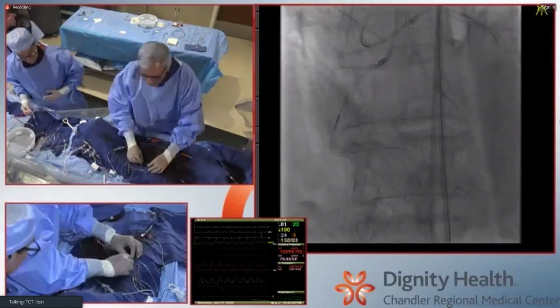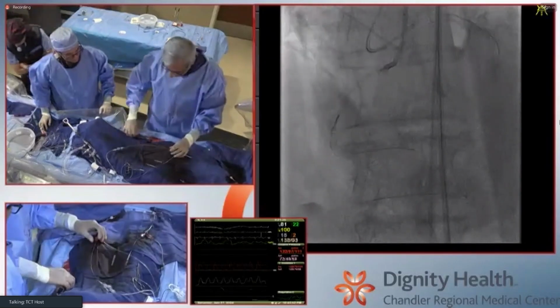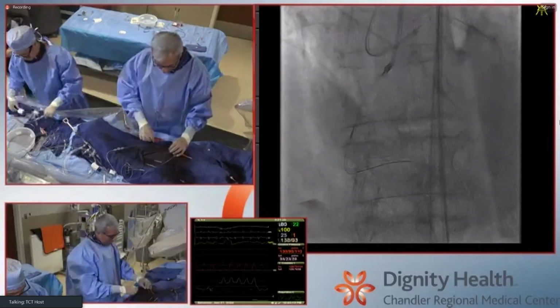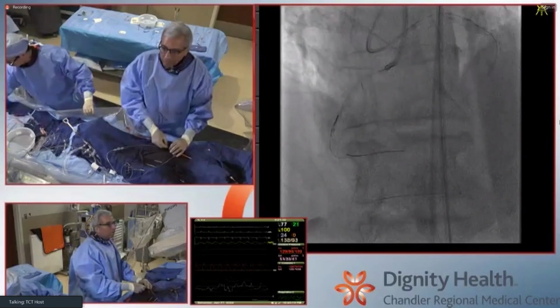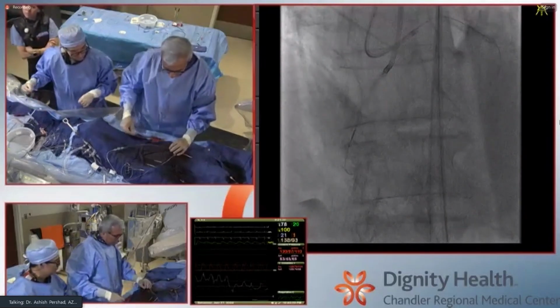No, we've done it too, but I just think that the problem in this space and in general in complex PCI is that everybody's enamored by tricks. Yeah. And many times tricks are good. Sometimes they become dominant and they should be used, and other times not. No, for sure. It's all good points. Those are style points, right?